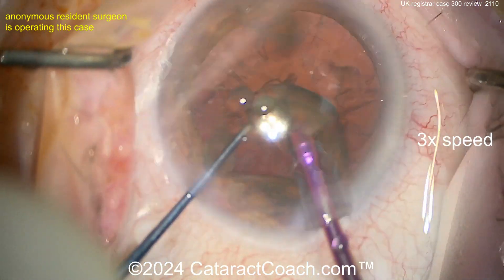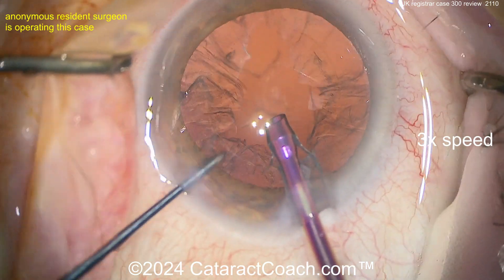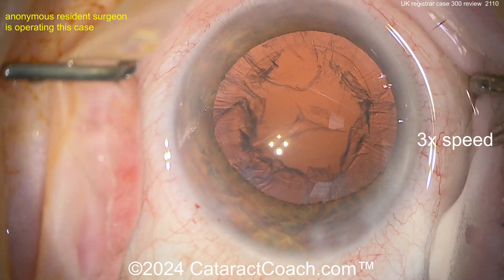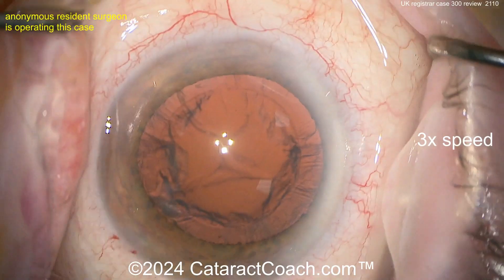Stop and chop is fantastic at case 300 — keep doing it, and then start to learn phaco chop: horizontal chop, vertical chop, the rest. You really do have the skill set here to learn that.